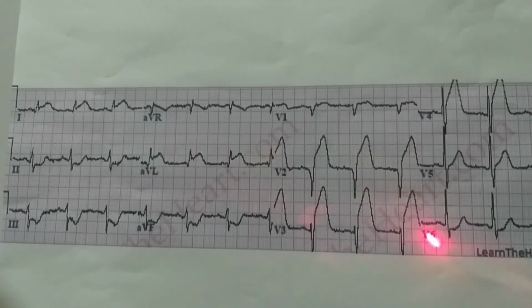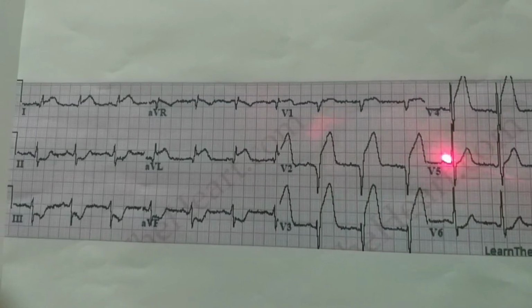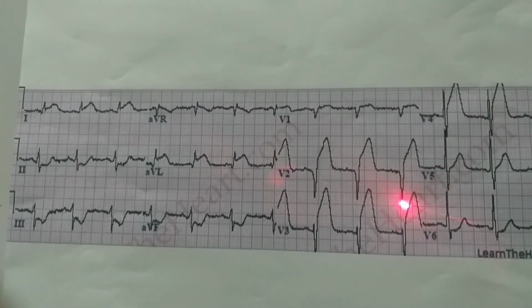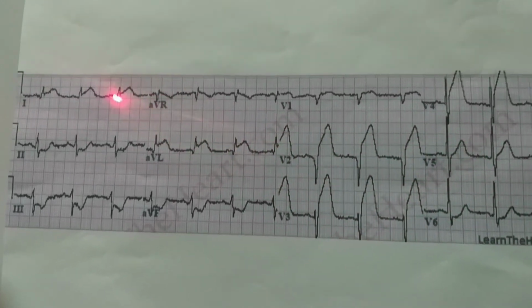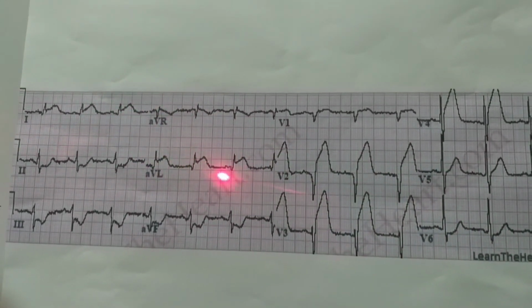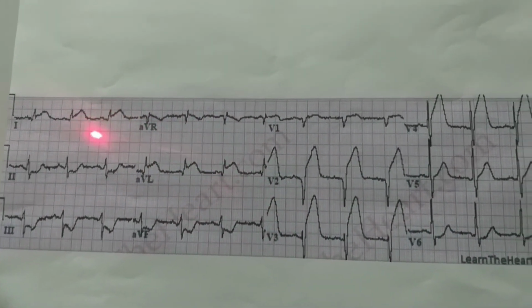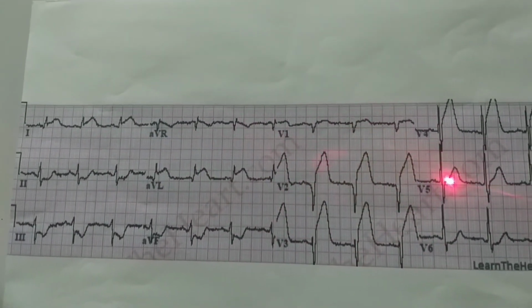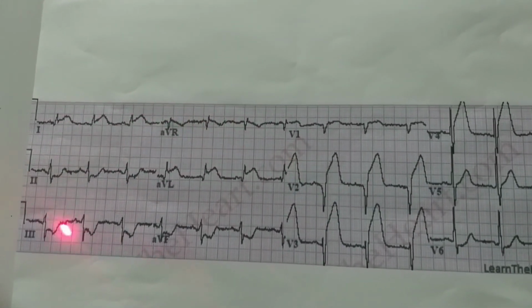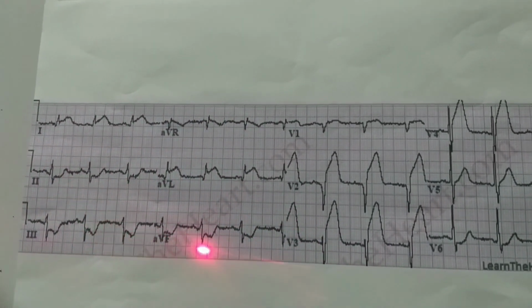So whenever a patient comes with chest pain, you will get the ECG after going through the ABC: airway, breathing and circulation. If you look at lead 1 and AVL, there too you find ST elevation, very prominent ST elevation in leads V2, V3 and V4, and reciprocal changes of ST depression in leads 2, 3 and AVF.